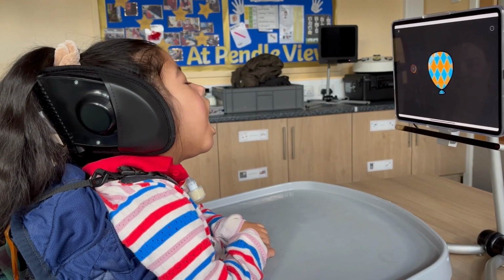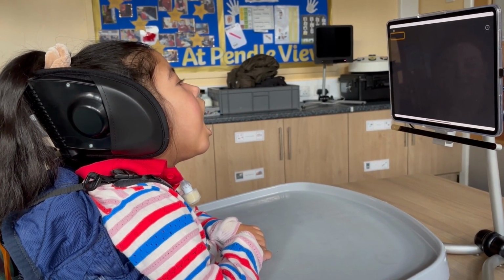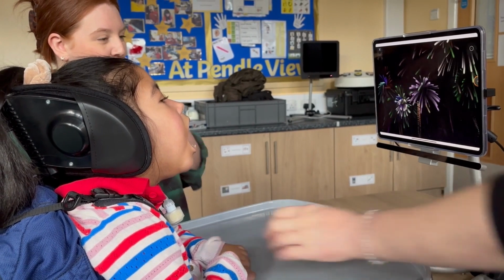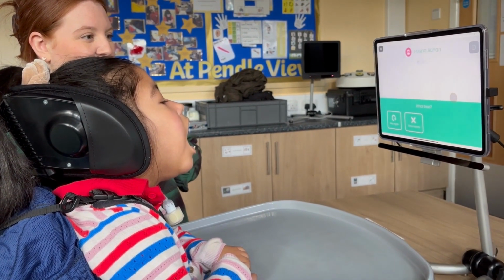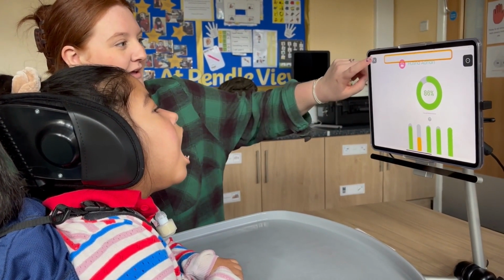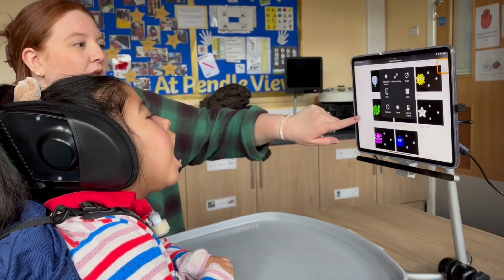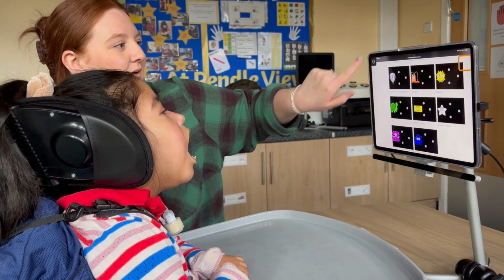Can you find it? Good. Wow, what a superstar. Well done. Even better. Wow. Should we have a look? Oh, we're really pushing it now. We need to get a bit more advanced.